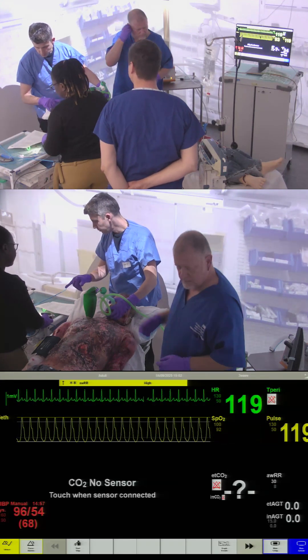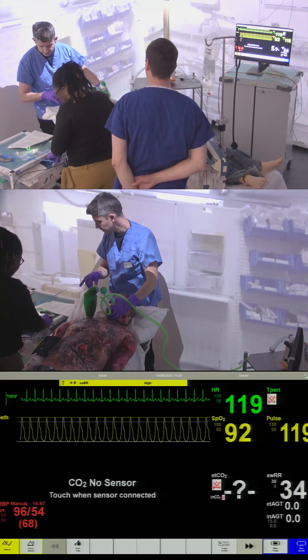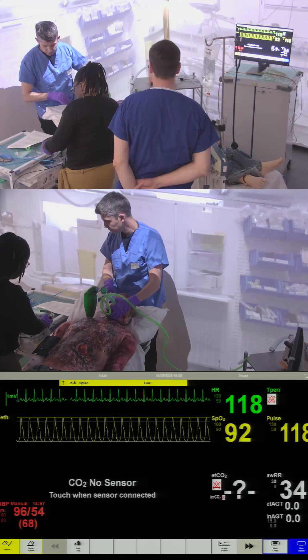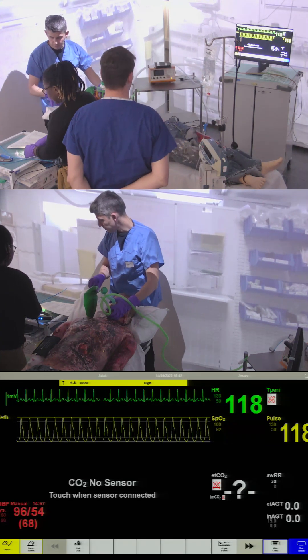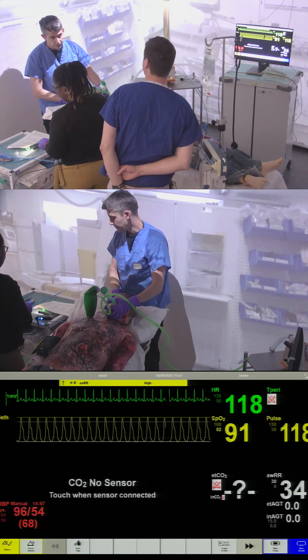We've got a size eight and a half tube. Have we got smaller tubes in the event of failure? Yeah, we have. Does the cuff work? It does, I've tested it. And we've got a C-Mac — C-Mac ready. Uncut tubes, that's important as well.